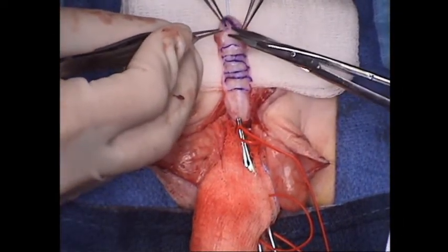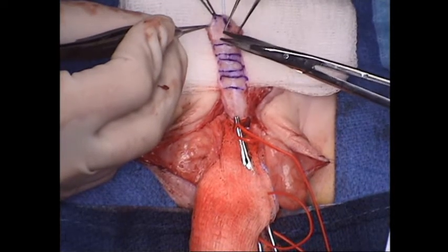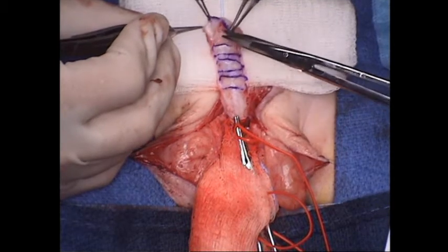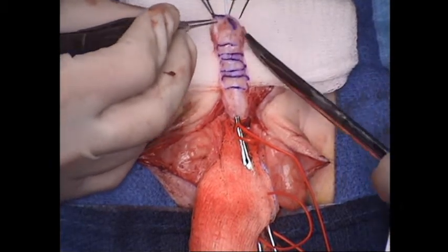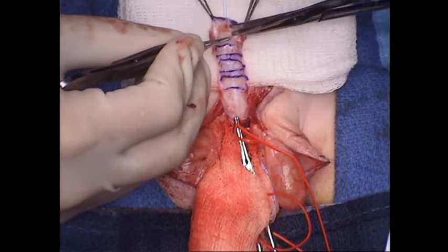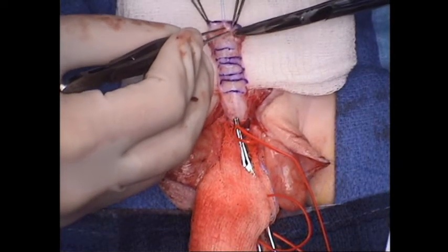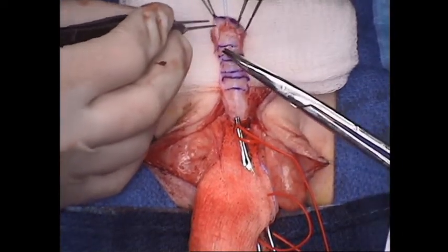So now when we do our glans wings, we've just made a midline incision. We did that superficially with our 69-blade knife. And we're going to carefully dissect the wings of the glans off of the underlying corpora. It's really important here to make sure that you dissect these wings open widely, because a major technical problem is if you don't put enough graft within the glans itself. So these glans wings have to be opened widely in order to ensure that there's a sufficient amount of graft in the glans. Otherwise, the caliber of the distal urethra at the second stage will not be sufficiently wide. So this has to open out like a book.